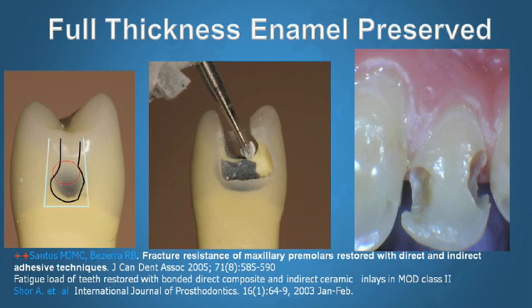As long as we have a full thickness of enamel, we can preserve that enamel, and the benefit of doing that is that I'm leaving the margin above the gum. Can you see that on the distal portion? That makes restoring that tooth a lot easier. If I was going to go with the traditional rule of no enamel without dentin support, then my preparation would go considerably below the gum, and restoring would become considerably more difficult.